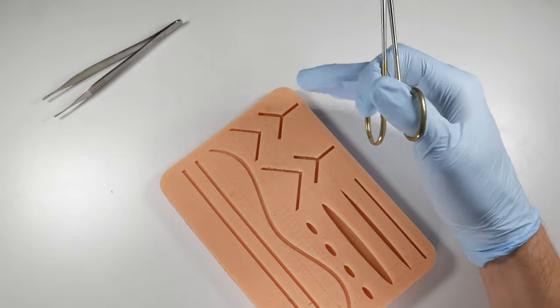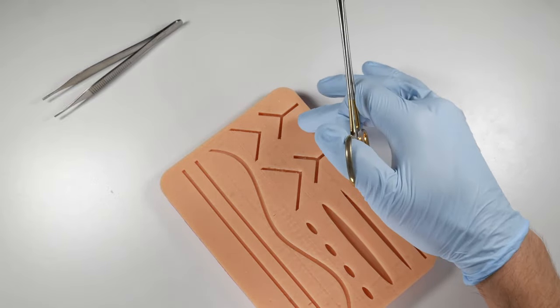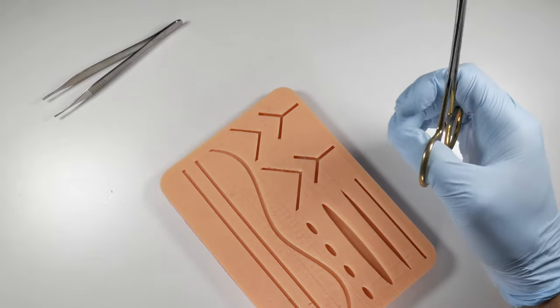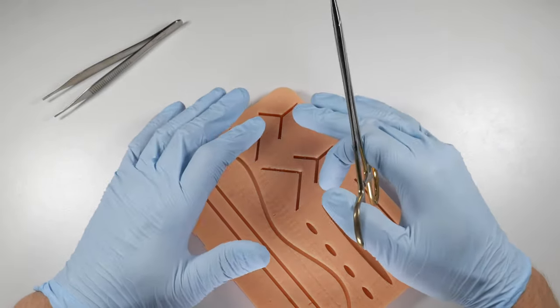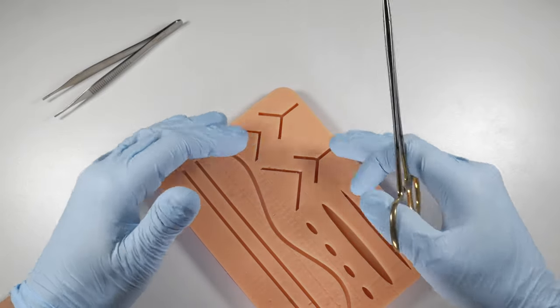Make sure that you identify the bleeding area before you suture over. Suturing for hemostasis is a good practice if you're managing the patient properly and monitoring them afterwards.